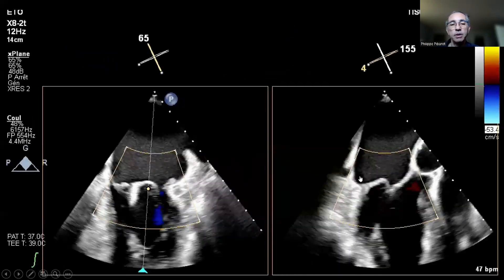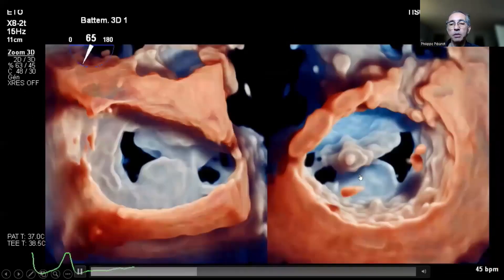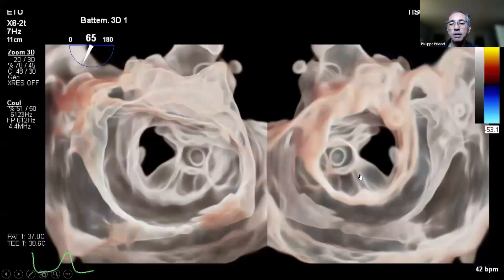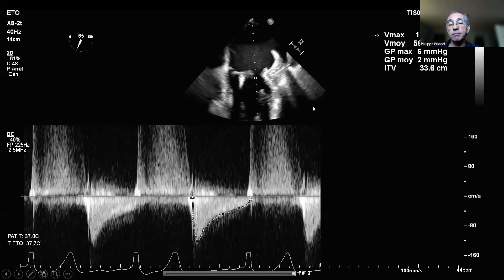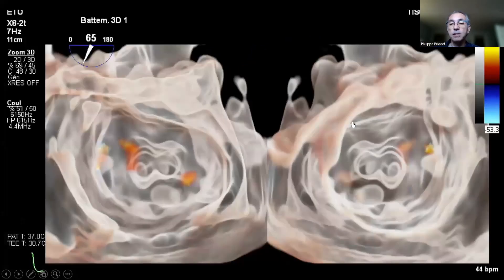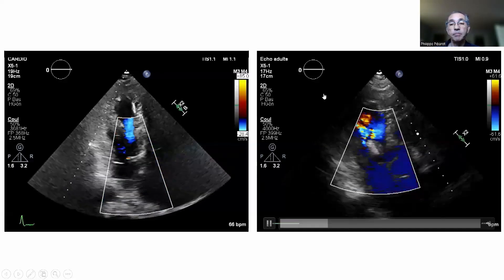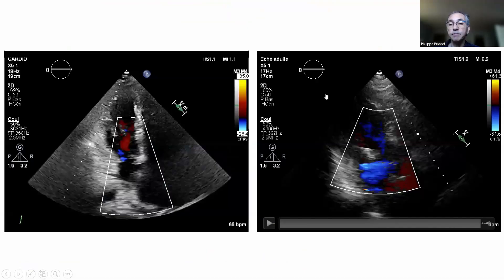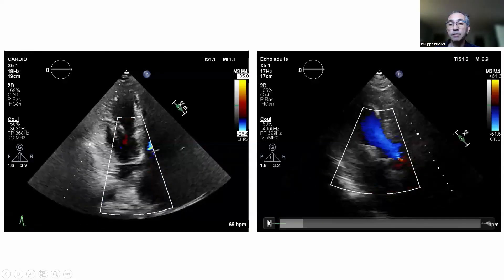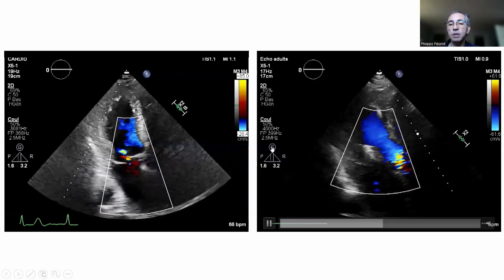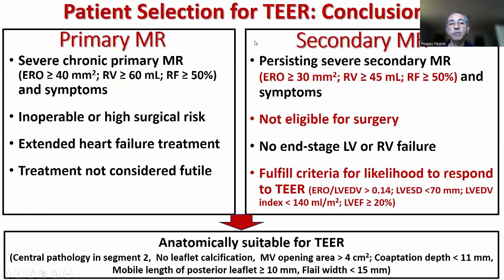After the first clip, results were good but more was needed. We checked for iatrogenic mitral stenosis: mean gradient of 2 mmHg — no evidence of stenosis. A second clip was placed; again, mean gradient of 2 mmHg, very stable, no mitral stenosis. The final result showed only a trace of MR after placement of these two clips.